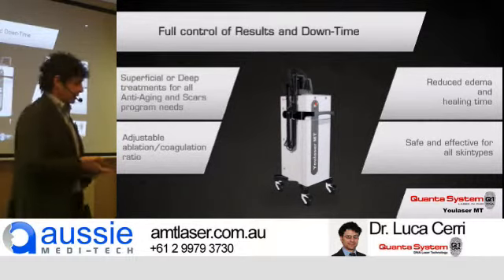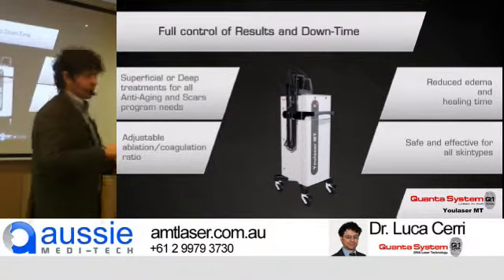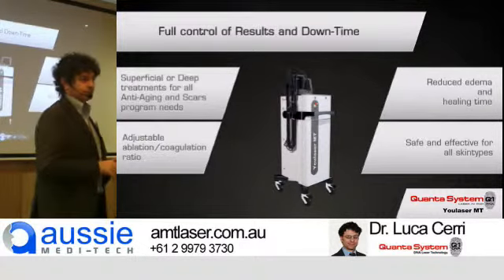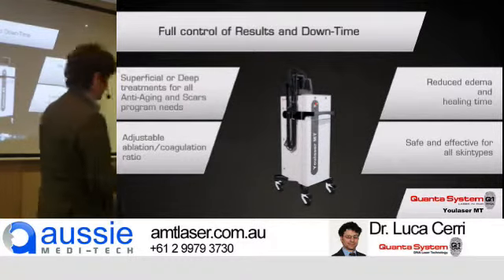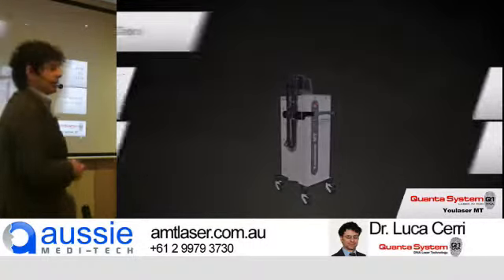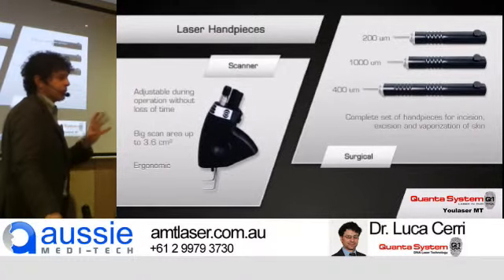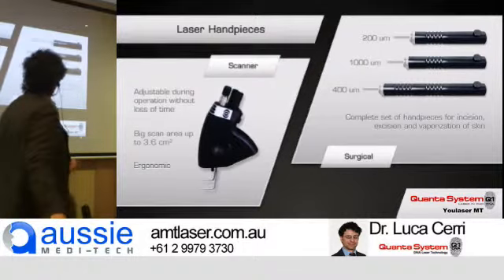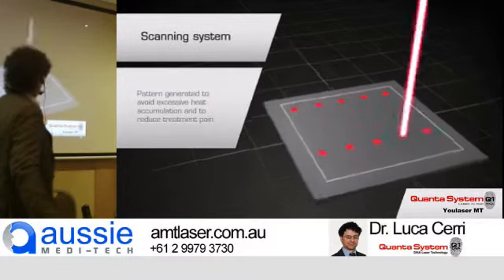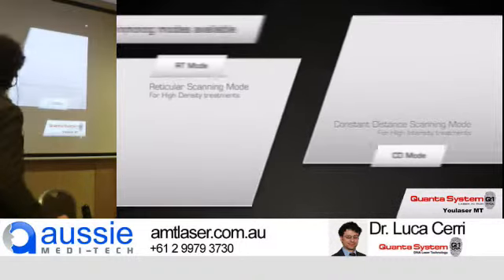With this device, first you have both the wavelengths on board. So the first approach is I can switch on one or the other one, and depending on the patient I have in front, I can select the right approach for this patient. But what is really new in this device is that using them together, we can take the advantages of both the wavelengths for each patient in a single session. We can do that reducing, anyway, the healing time, so reducing the downtime, and increasing really, in some conditions visibly, the outcomes of the results.